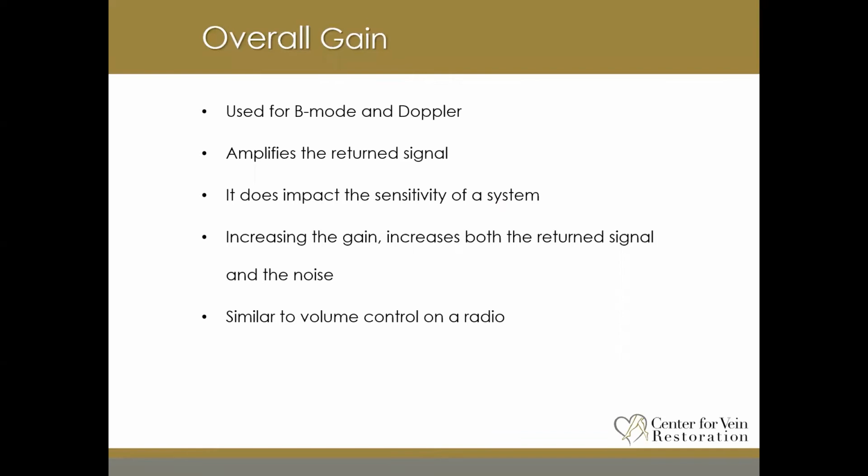The overall gain, whether it's B mode or Doppler, boosts the amplitude of the return signal. This is known as post-processing. Therefore, no extra power or energy is used on the patient.